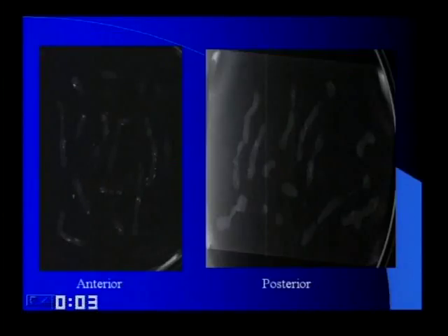So we sampled the anterior grouping. This is the most anterior. This is the most posterior. Stereotactic, we always do specimen radiographs to make sure we have calcifications. Okay, and what do you think the pathology was, Chris? Ductal carcinoma in situ. Okay, and what are the two types of DCIS?